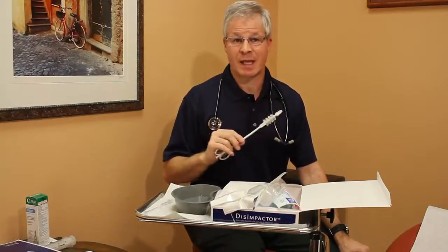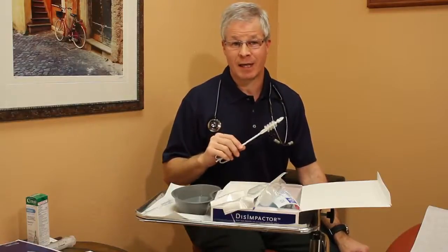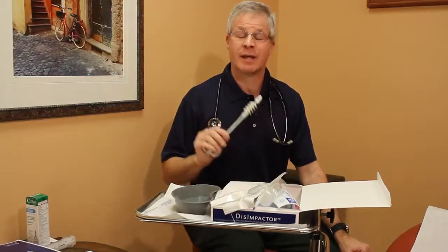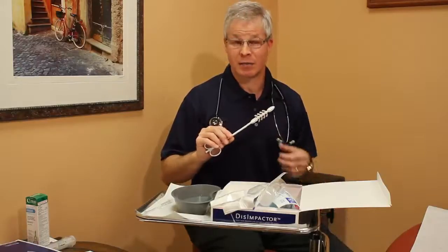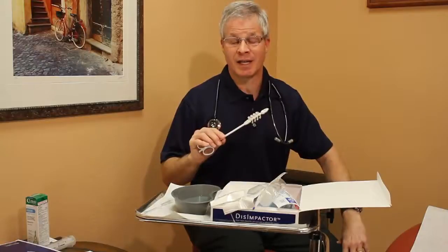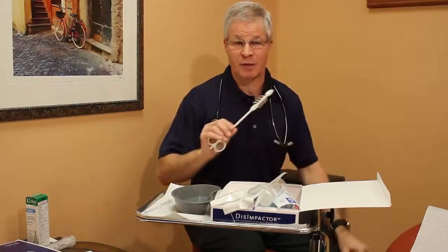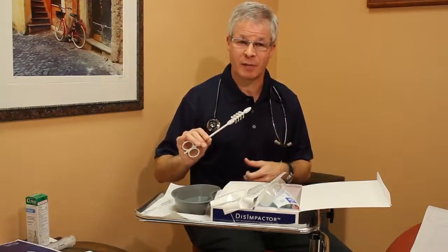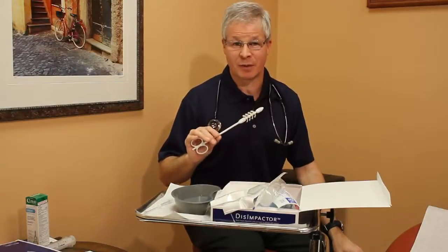What you'll need to assess at that point is where we're at in the procedure. Rarely will you have relieved the entire impaction with a single pass. That's really not what the device is intended to do. Essentially, the device will likely fragment the stool, and what you'll see is that pieces of stool will come out, or there'll be stool affixed to the device, but it's very uncommon to get that candy apple, so to speak, where the entire impaction is on the first device. So plan on understanding it from that point of view, because our goal is to really fragment the fecal load and get to the step where we're administering enema fluid.